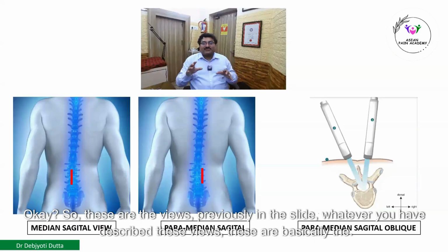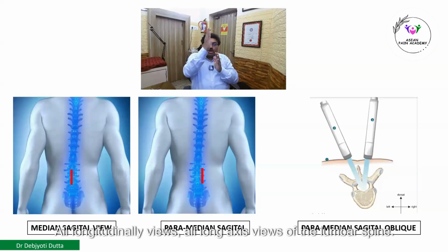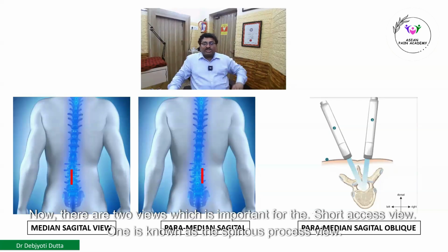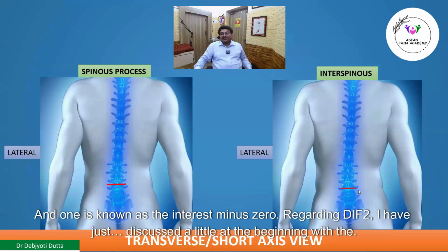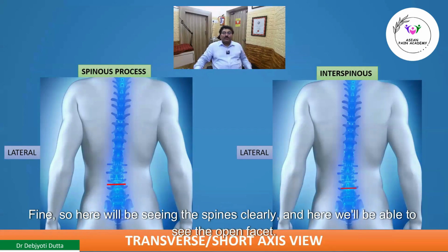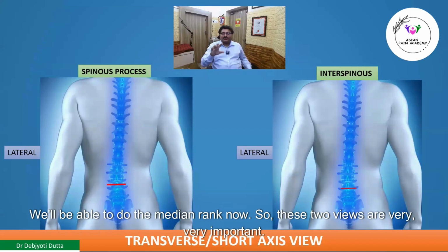Whatever views we have described in the slide, these are all longitudinal or long axis views of the lumbar spine. Now there are two views which are important for the short axis view. One is known as the spinous process view and one is known as the interspinous view. Regarding these two, I discussed a little at the beginning with the spine. Here we'll see the spines clearly, and we'll be able to see the open facet and do the medial branch block. So these two views are very, very important.